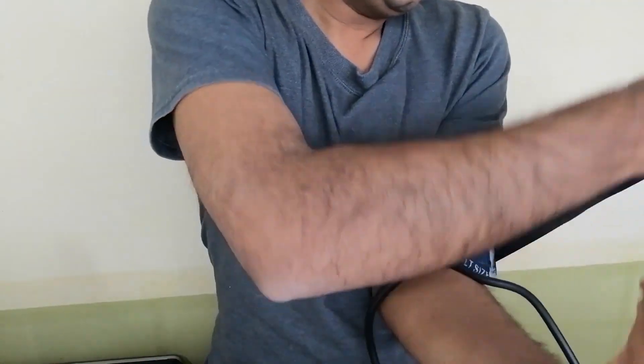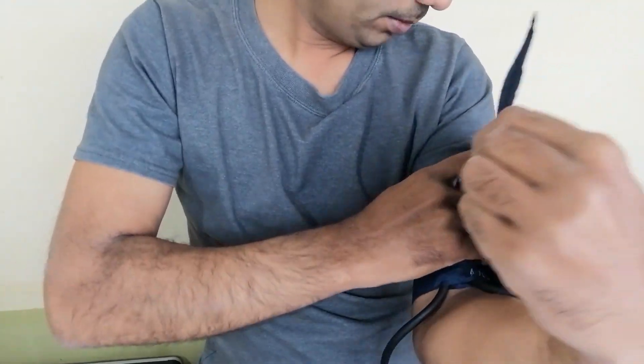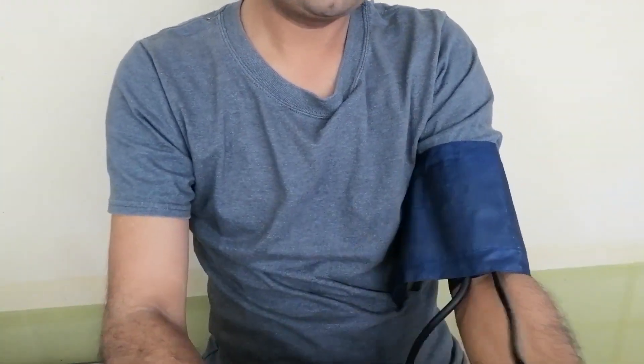I press it with my hand and then hold it, then I tie it here. Friends, you don't have to tie it too loose, nor too tight.